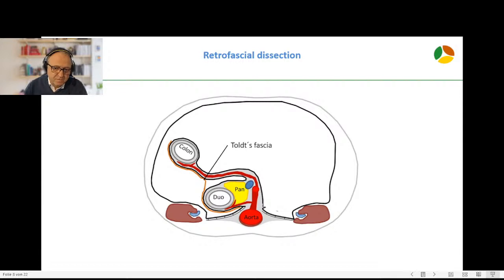We also do a retrofascial dissection. This means we start the dissection behind the duodenum in a medial to lateral fashion, which mobilizes the right hemicolon just like in open surgery. Toldt's fascia remains intact and connects the duodenum with the mesocolon in the first step. Only in the second step do we enter Fredet's space, in which duodenum and mesocolon are separated.